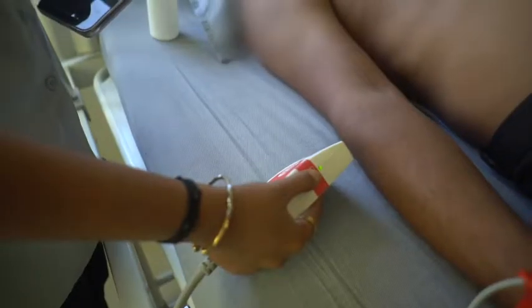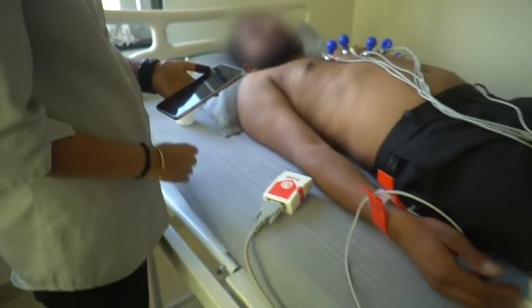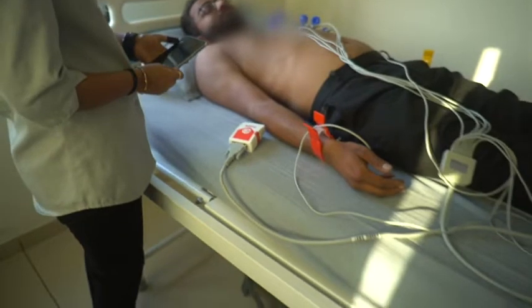Now long press the power button on the device to turn it on. On the other side of the device, the Bluetooth LED will start blinking.